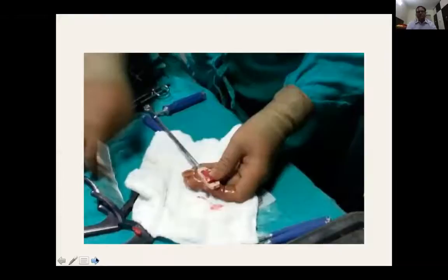So this is the cage which has the lordotic angle, and then one can place bone graft also, and the amount of bone graft is almost 3 times what we can use in the posterior fusion. And this is how it looks after the end of the fusion with an AP X-ray. The markers should be coinciding in the midline, and the lateral markers should be just beyond the pedicular line.